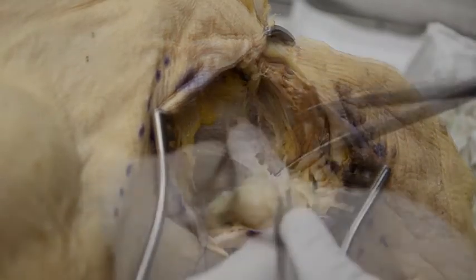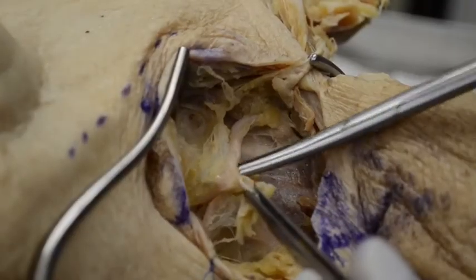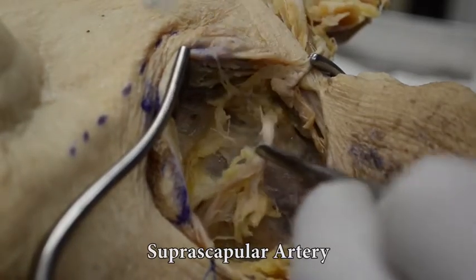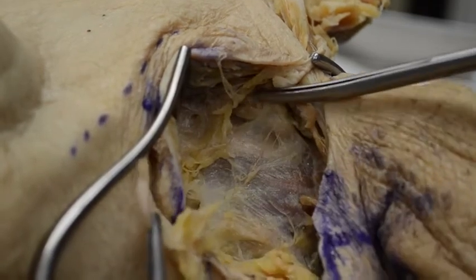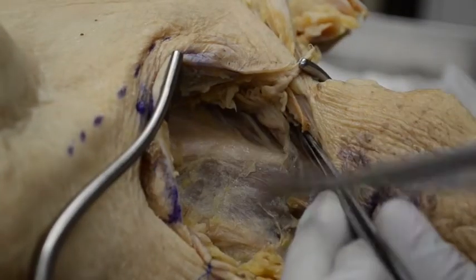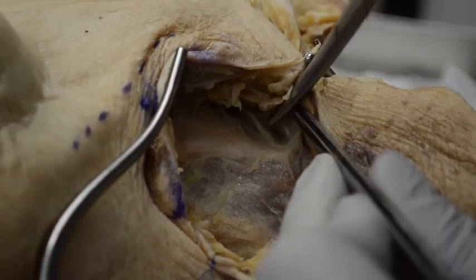With continued dissection of this fat pad, we are going to identify the suprascapular and transverse cervical vessels as we get closer to the clavicle. Careful identification of those vessels, then ligation and transection, would avoid unnecessary bleeding and retraction.